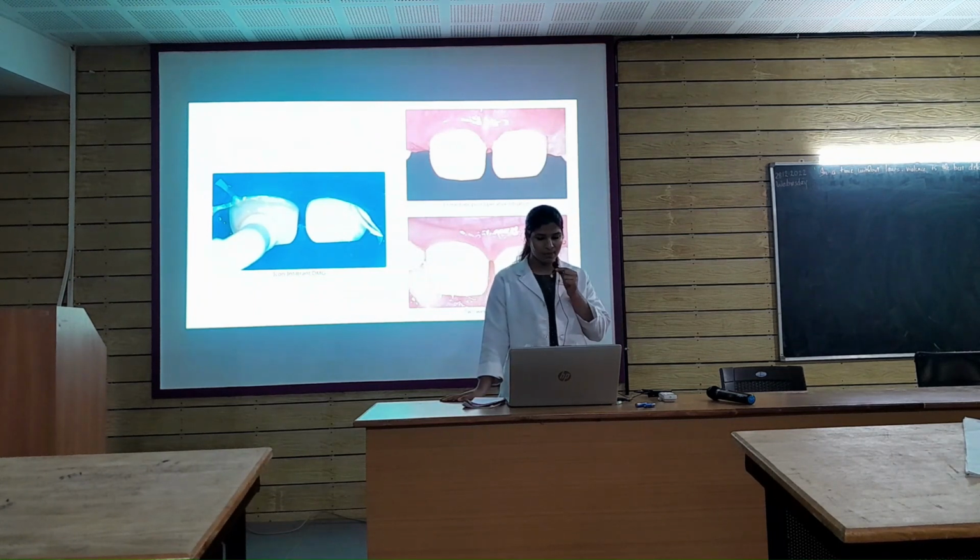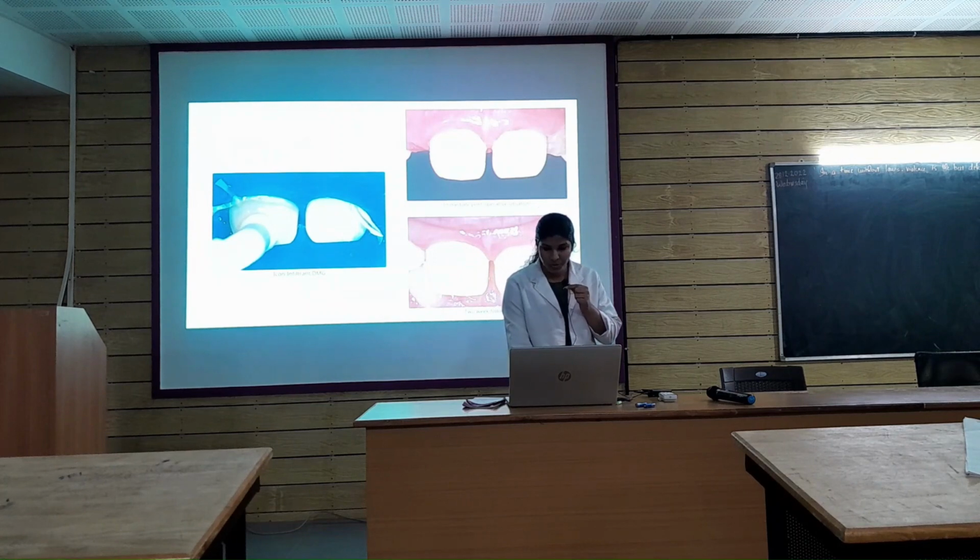This is the post-operative condition. The first picture is the immediate post-operative condition, and the second one is the 2 weeks follow-up.